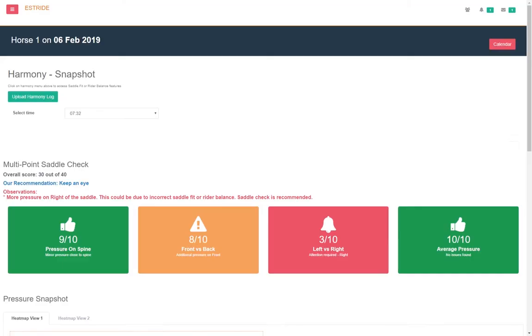Harmony Equine Pressure Mat. The Harmony Pressure Mat shows you distribution of pressure under the saddle using 920 sensors. It records data on the SD card and once the data is uploaded on my eStride portal, it can be analysed in detail.